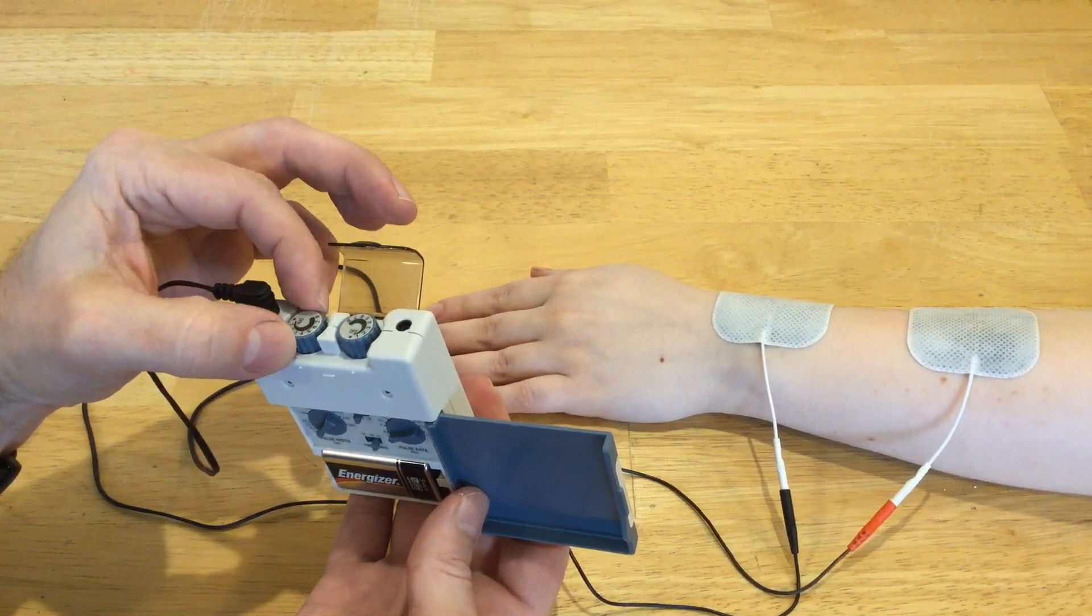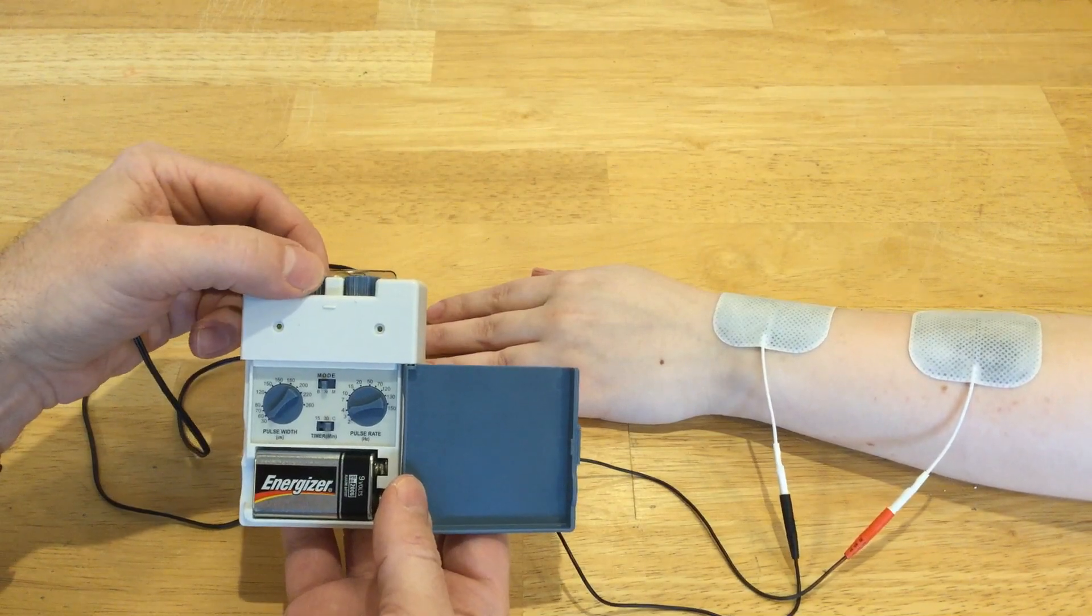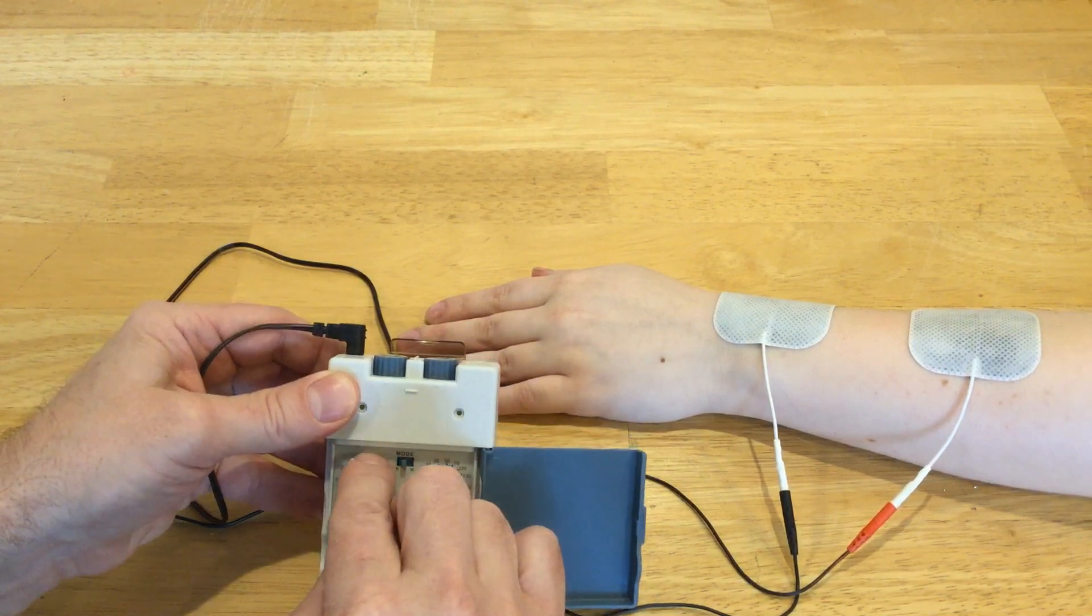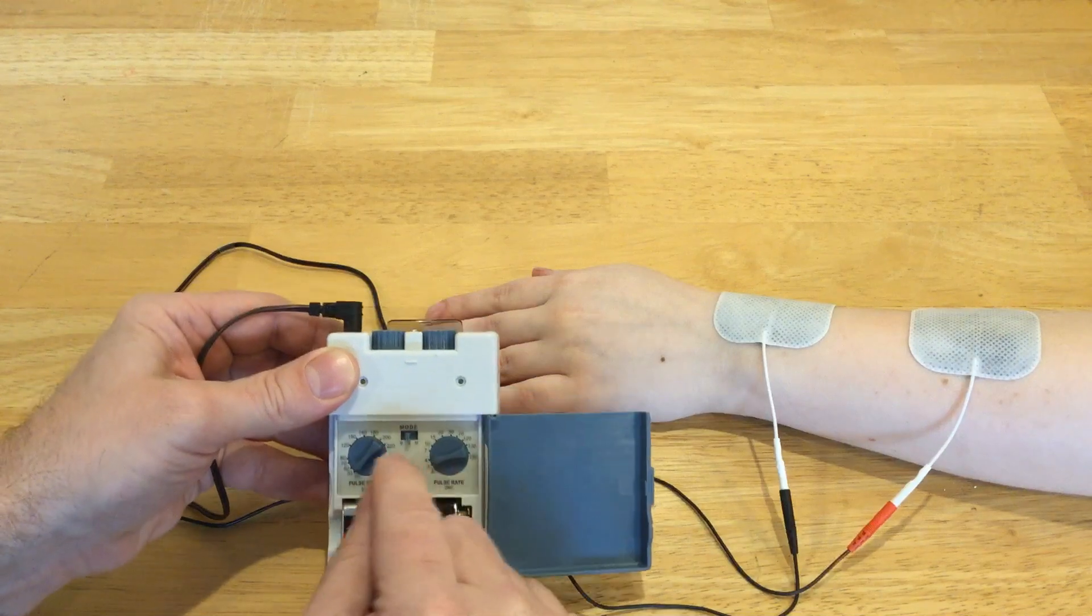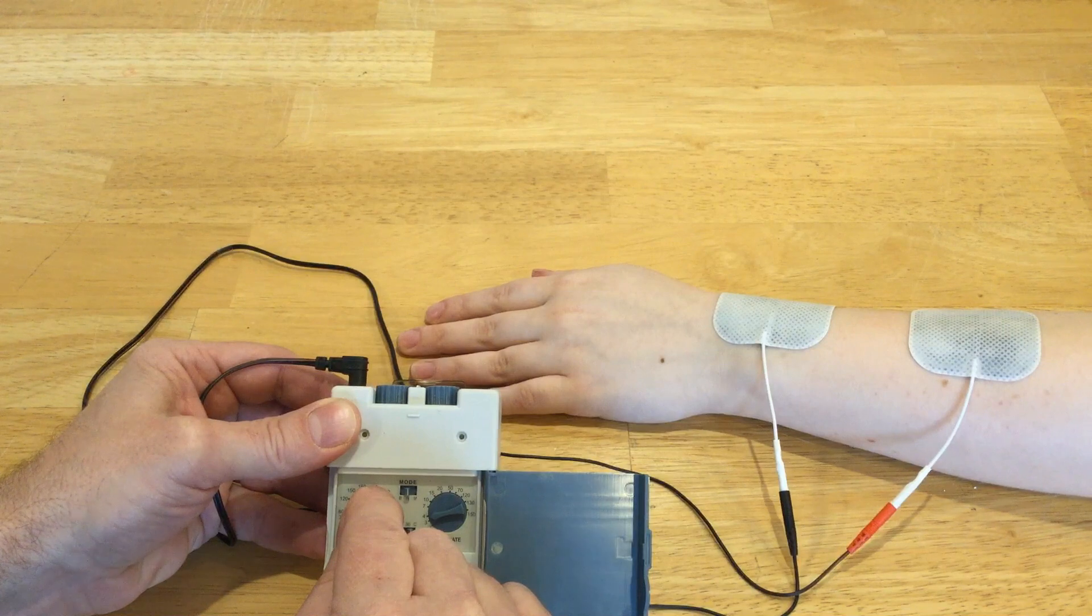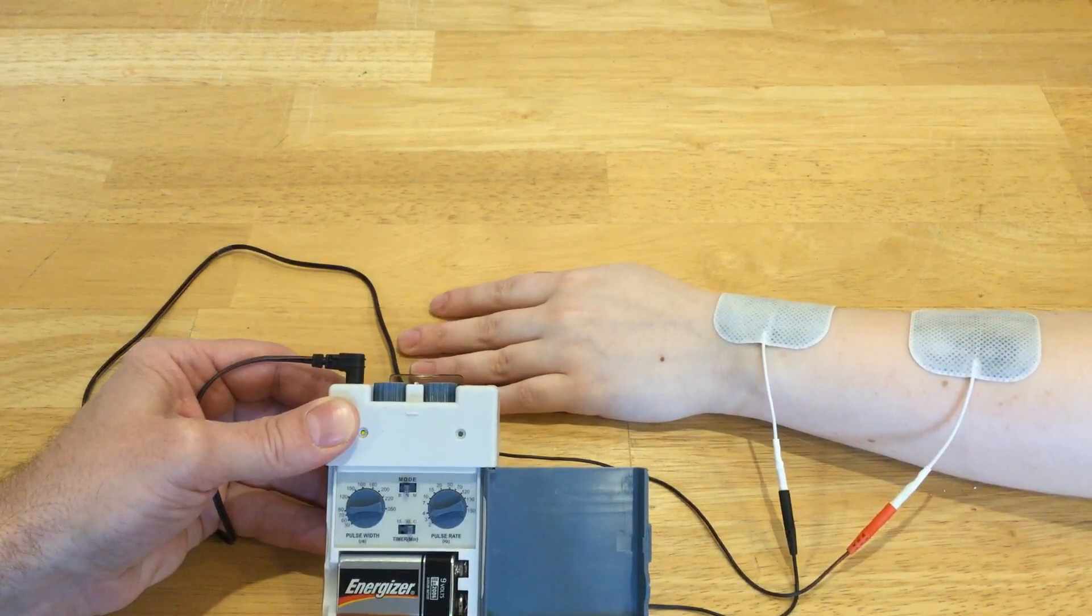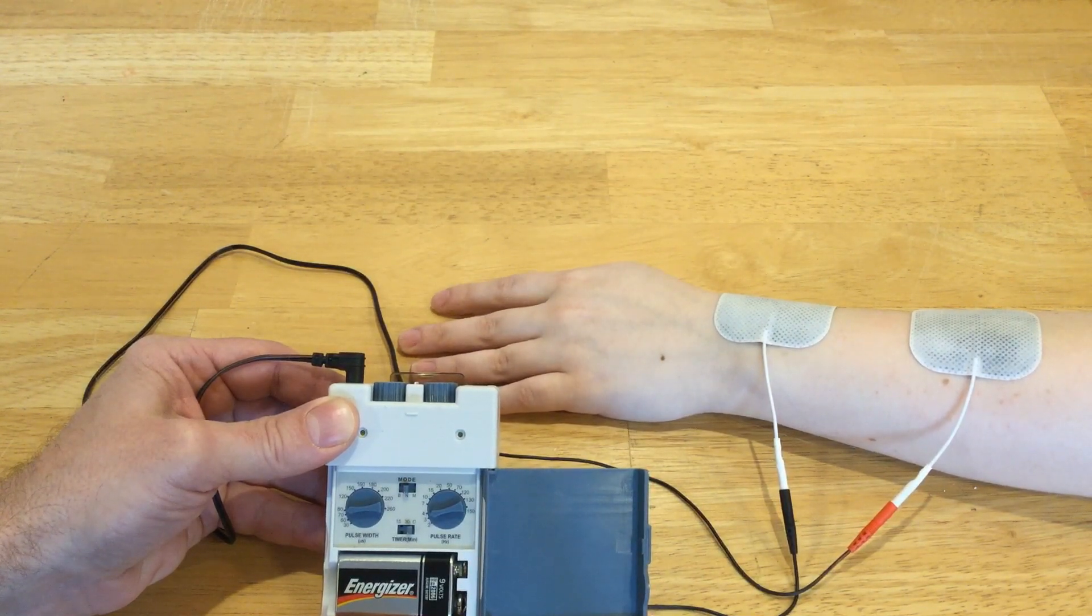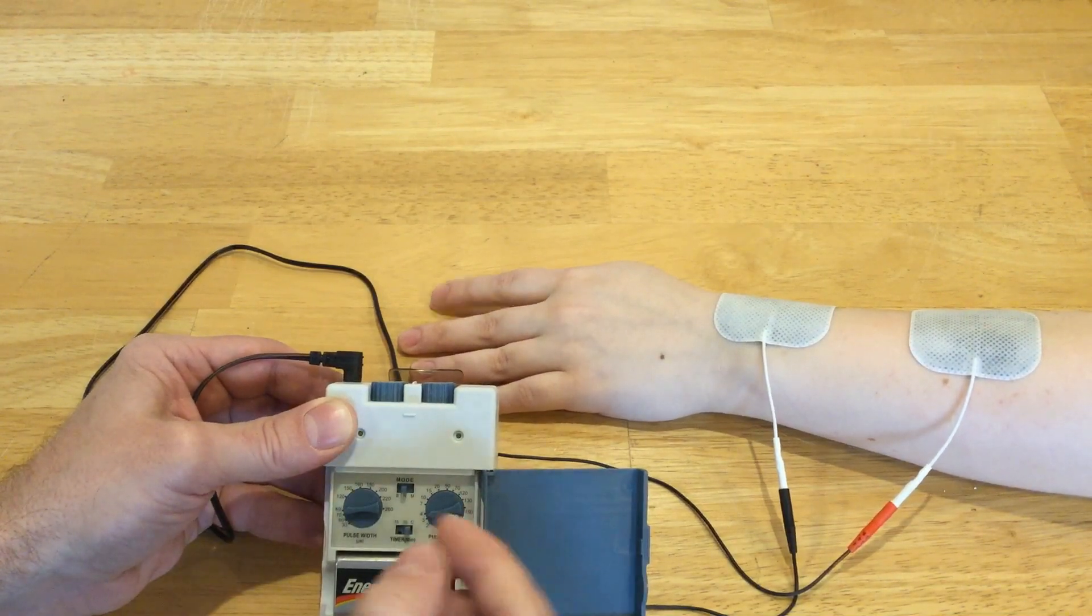Now I'm going to put this somewhere in the middle here. How does that feel? Fine. And with that set somewhere in the middle, I'm going to slowly increase my pulse duration. So my intensity will stay fixed and I'm going to increase the pulse duration. And we'll see what happens with that. Now you can see by increasing the pulse duration, we've crossed the motor strength duration curve. And I did that just by increasing pulse duration or pulse width.